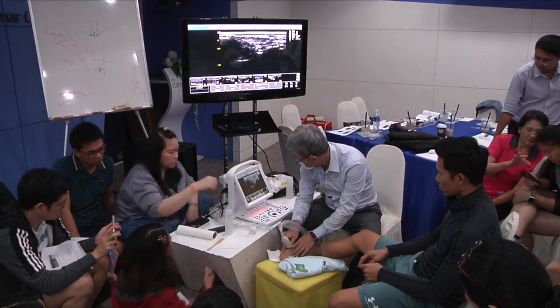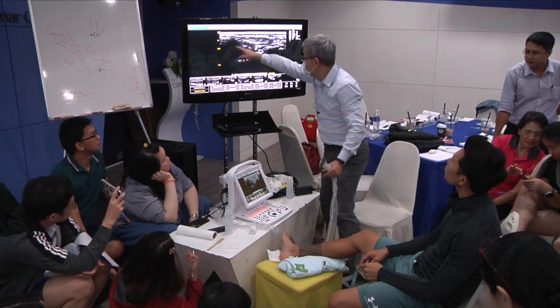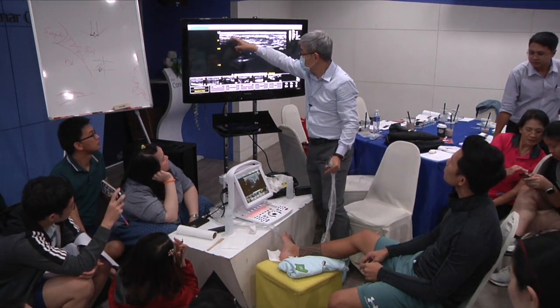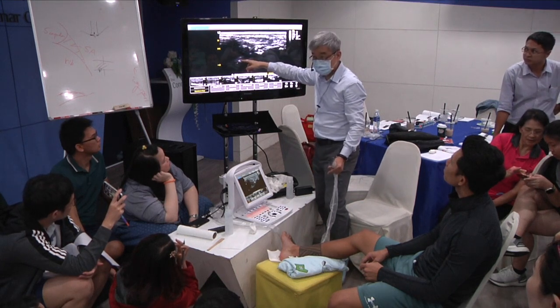Can you freeze for me? There's like a valley. There's a gap in here.